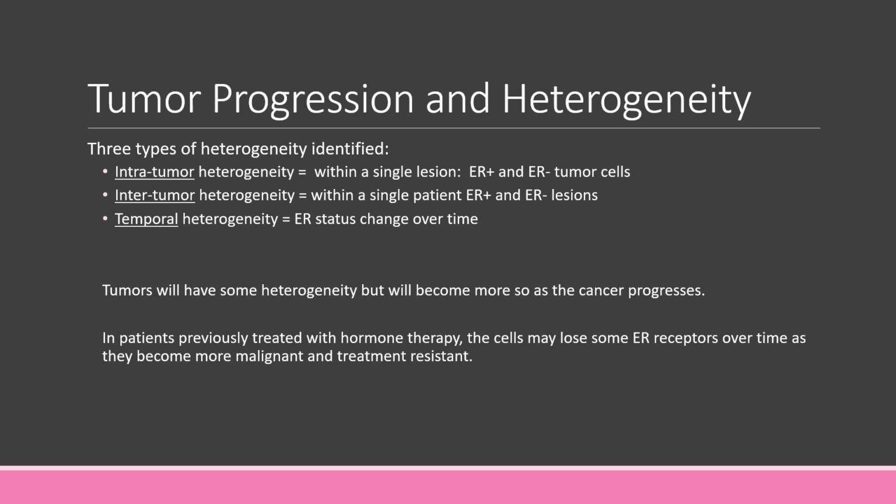Treatment decisions from a single biopsy could be ineffective if the patient has heterogeneity, and an FES scan can assist in characterizing the lesions in the whole body to determine the extent of heterogeneity, which ones are ER positive and which ones no longer are. So if a single biopsy is made at a single site at a single point in time, the treatment could be based on that, but that information is incomplete and imperfect. So the patient could be placed on an incorrect or inadequate treatment plan.